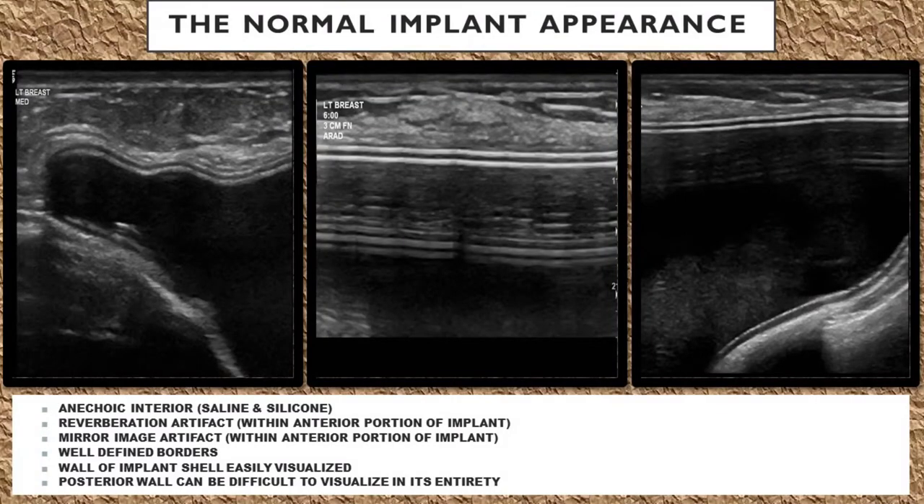Let's talk first about the normal appearance of a breast implant on ultrasound. The interior of the implant should be anechoic for both saline and silicone implants.